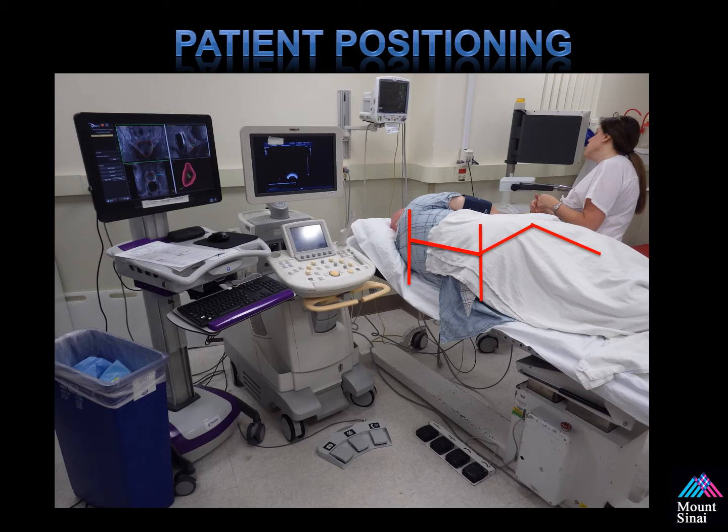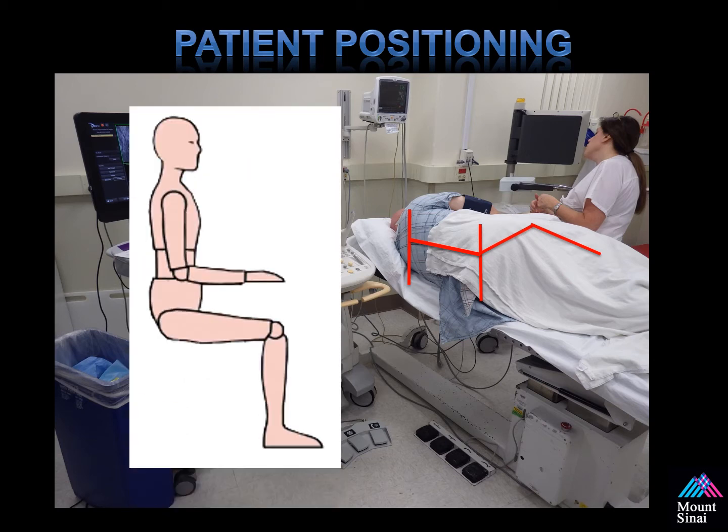Patient positioning and setup is always important. The patient is placed in the left lateral decubitus position. Notice how the shoulders, hips, and knees are all squared up. This allows for easy orientation, and the machine seems to function better when you're not adjusting for a secondary rotation of the patient. The first machine is the ultrasound machine, placed next to the patient for high-resolution evaluation of the prostate during the procedure, and the technician works on the left with the Uronav device. It's always important to square the patient up — shoulders, hips, and knees.